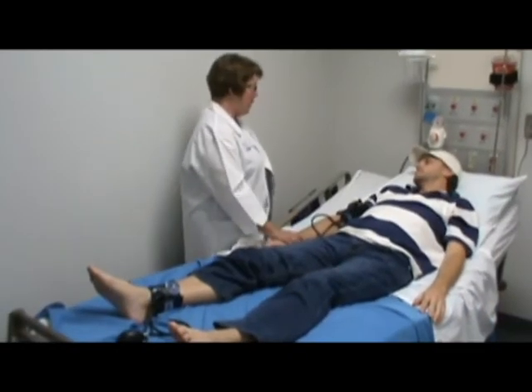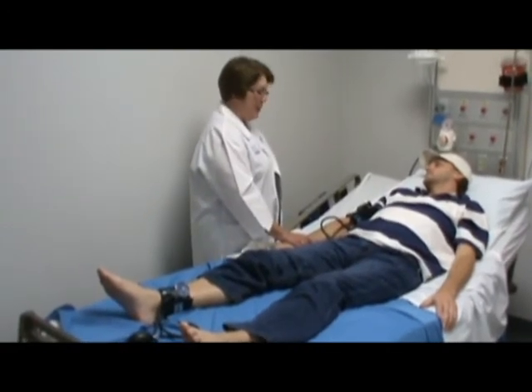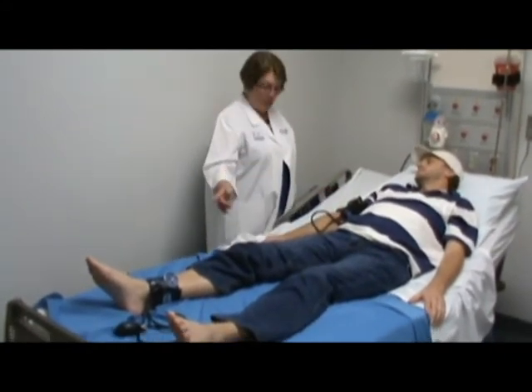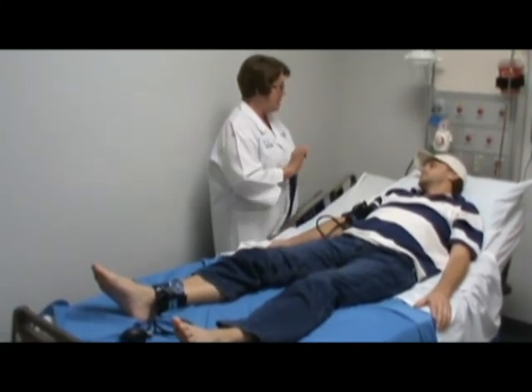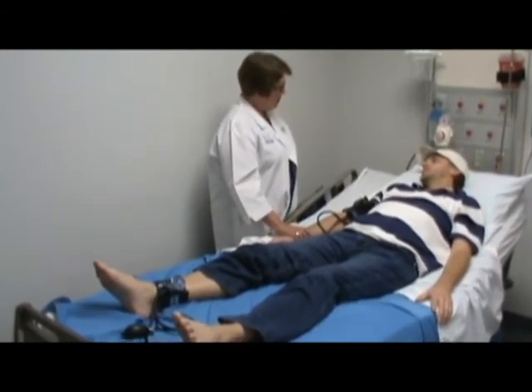Good afternoon, Mr. Miller. How are you doing today? I'm okay. Good. We're going to be doing a procedure called an ABI index. What that means is we're going to be doing your blood pressure at your arm, and we're going to take a blood pressure at your ankle, and it will give us a number that will tell us how well the blood is flowing through your arteries. Okay. Do you have any questions? Not at this time. Okay. Let's begin.